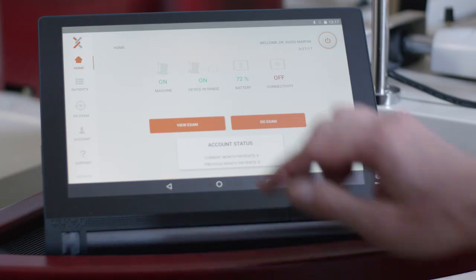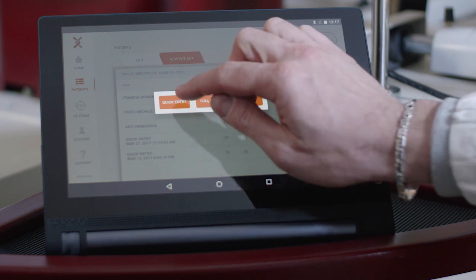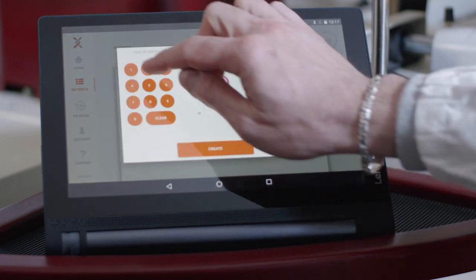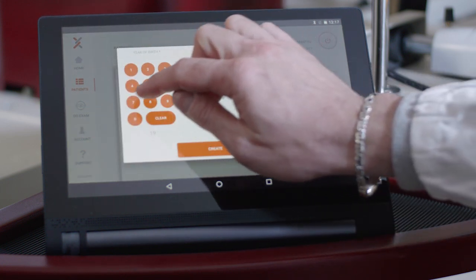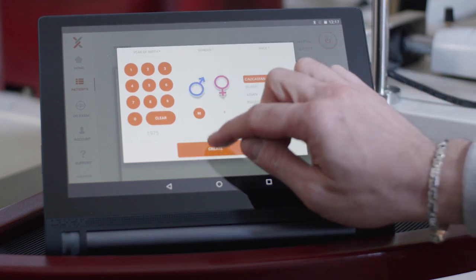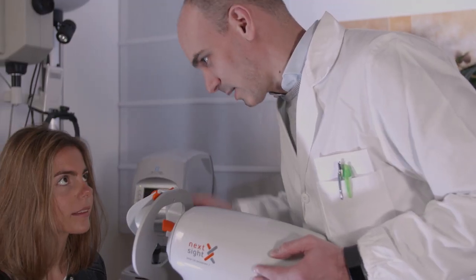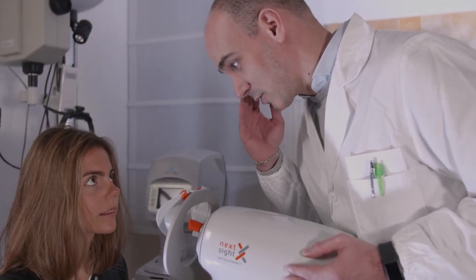Entering the required information about a new patient is quick and simple. During the examination, the patient places his or her forehead and cheeks against the orange pads on the face rest.